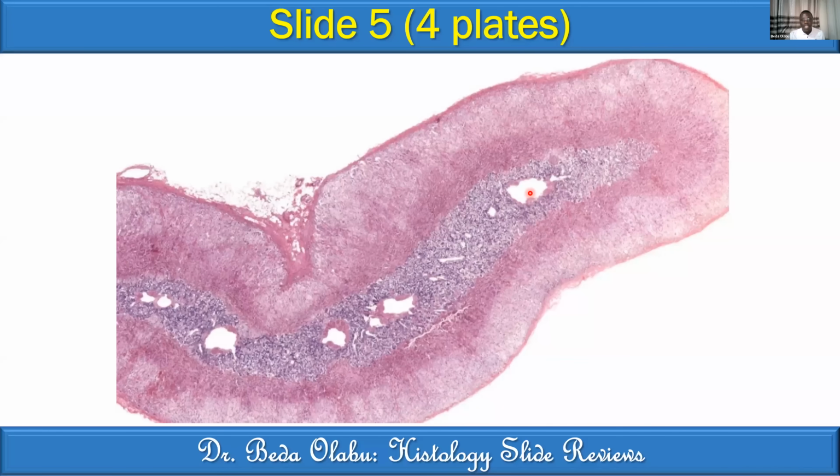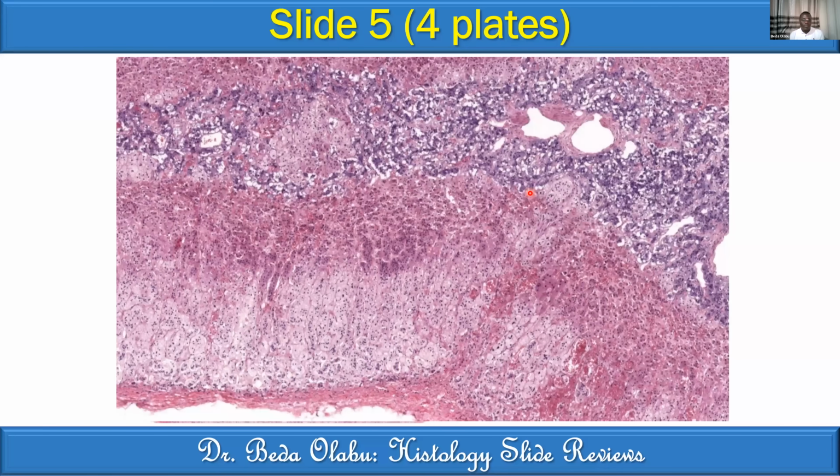All right. Anything else in addition? Maybe I give you the highest magnification. What's new on that third magnification? In the highest magnification, the outer layer, the cells seem to be in columns. Very good. Yes, columns. And this zone, what morphology of the cells? The cells are clustered. Very good. All right, let's write it. So Raymond, what's your identification? It's adrenal gland, according to me.